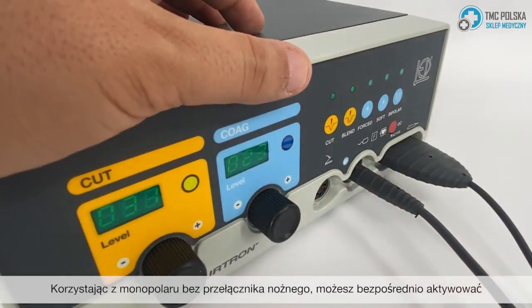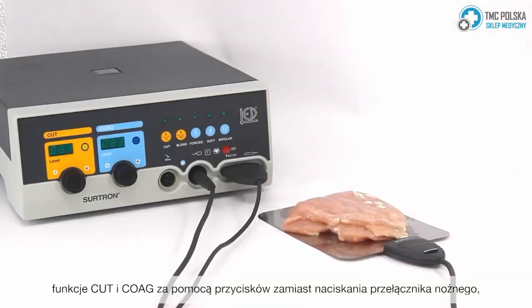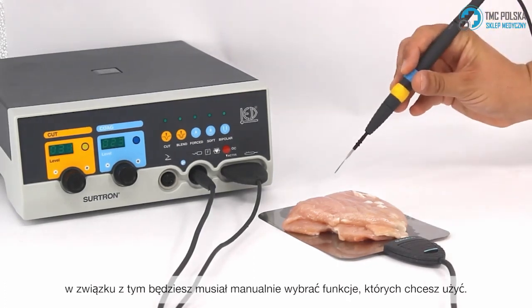When using the monopolar handle without a foot switch, you can directly activate the cut and coag functions by using the buttons instead of pressing the foot switch. As such, you will need to manually pre-select the functions you wish to use.